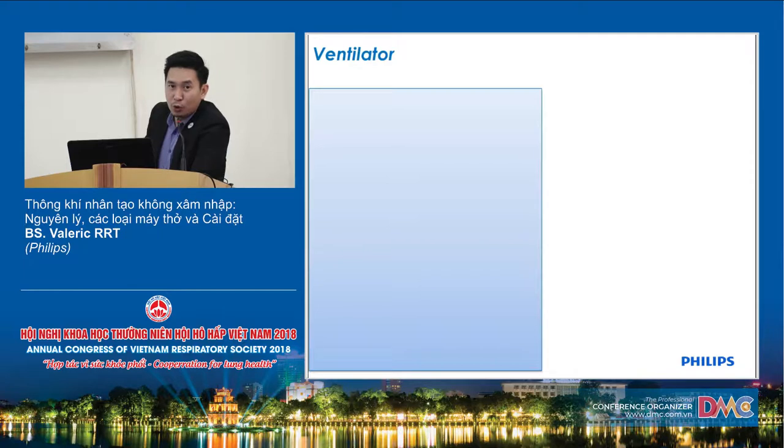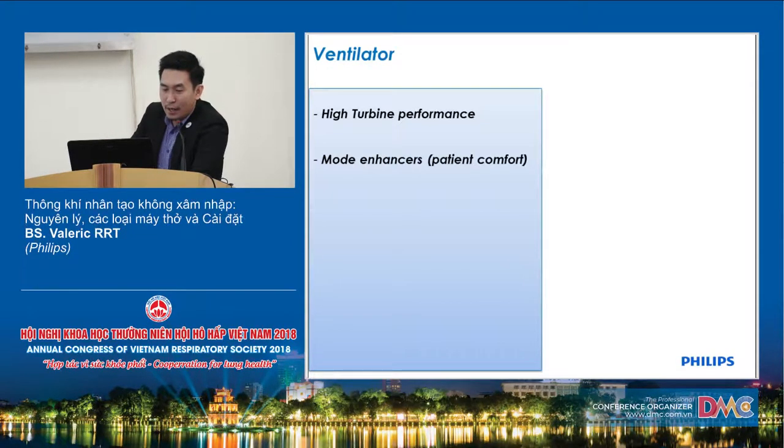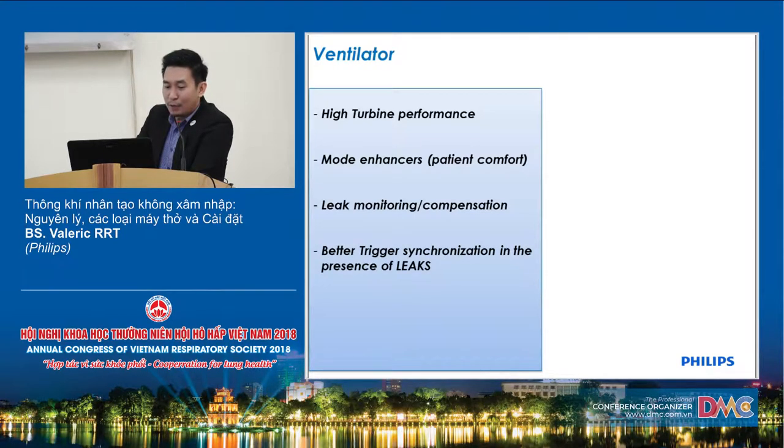So one of the requirements to deliver non-invasive ventilation successfully is that the ventilator must have high turbine performance: better pressurization, quick response and fast triggering. We also have mode enhancers during non-invasive ventilation for patient comfort, leak monitoring and compensation, and synchronization in the presence of leaks. Like I said earlier, one of the main problems in non-invasive ventilation is leak. If you have leaks, the ventilator cannot perform well. And quick pressurization and triggering as well.